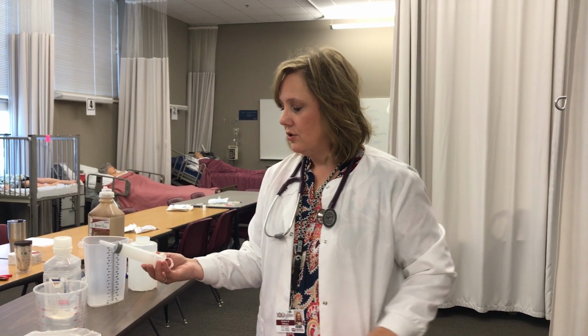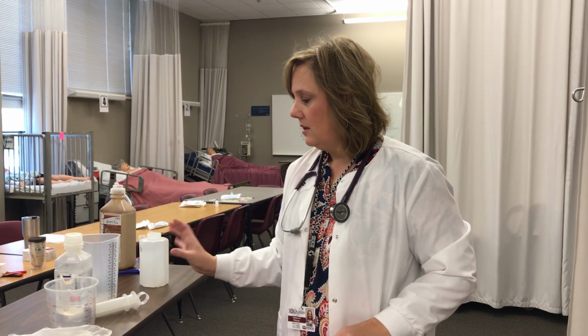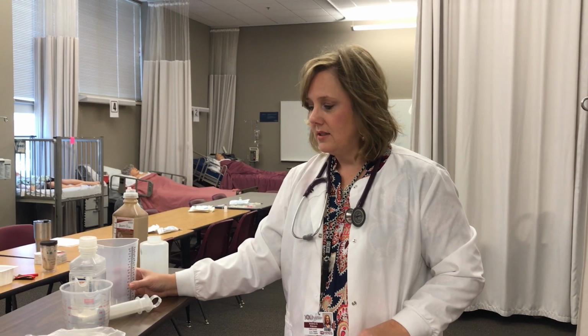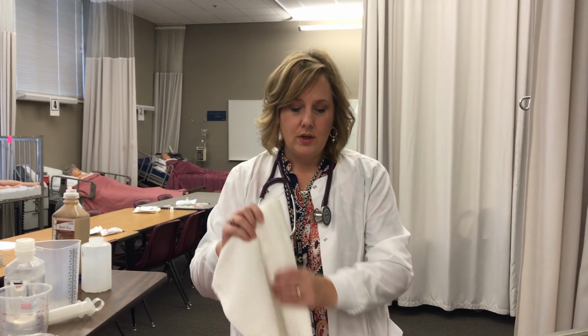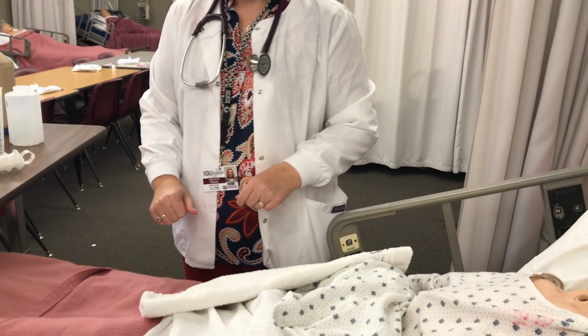It's a good idea to have all your supplies gathered before you go into the room. You'll need your syringe, you'll need your feeding, you'll need your water and some measurements, gloves, and it's also a good idea to use a towel as well, just to prevent getting the linen soiled.